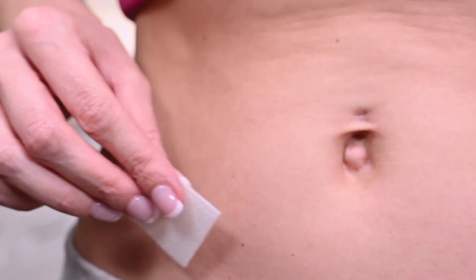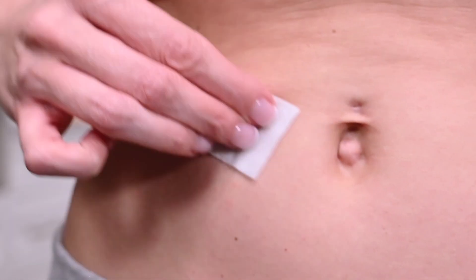Wipe the injection site with an alcohol prep wipe and allow the skin to dry. Make sure to alternate the injection sites between both sides of your body.